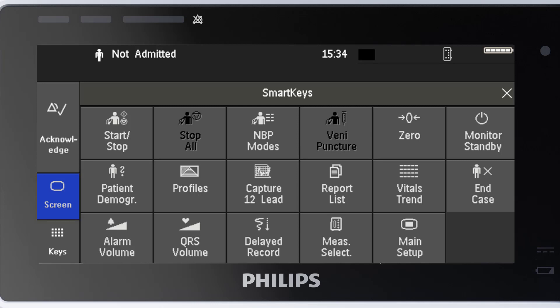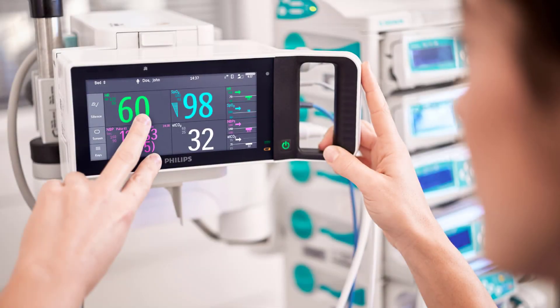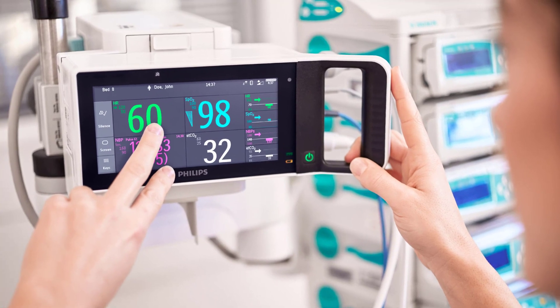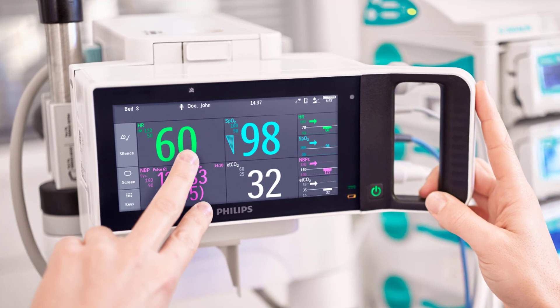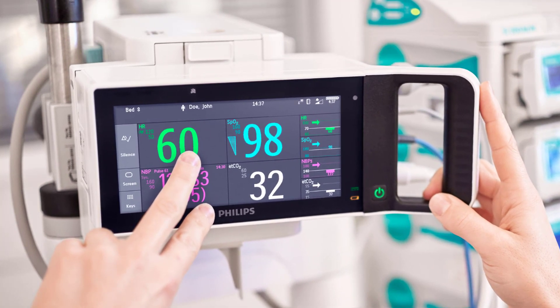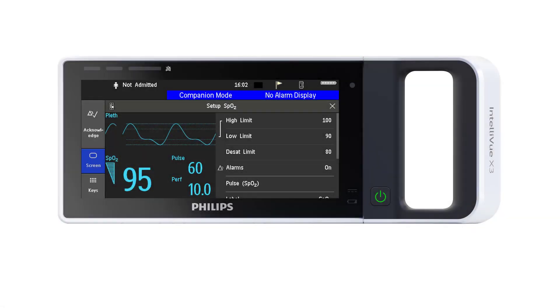Smart keys give you fast access to functions. Now that you know the different screen areas, it's time to discover how you can operate on the screen. It's a touch screen — what you see is what you get. Directly select the screen element you need. Use swiping to scroll through a menu. To select an item from a list or to select a key, tap on it with your finger. To close the menu, use the X on the top right corner of the window or the screen key.